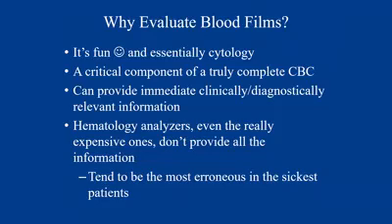So why do we evaluate blood films? I personally think it's fun. It's a little bit monotonous sometimes, but I do think it's fun. And this is a veterinary cytology Facebook page, right? And so when I was talking to Francesco about organizing this, I asked him, would it be okay to give this talk? Because this isn't technically cytology, but blood smear review is kind of cytology to some degree, right?